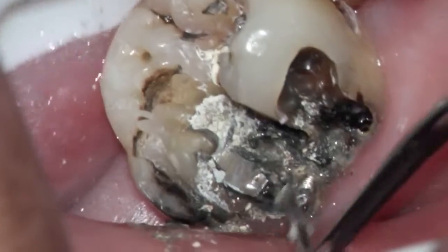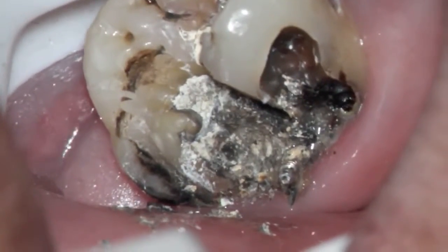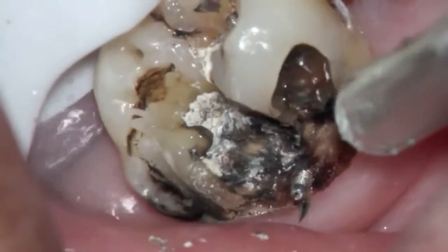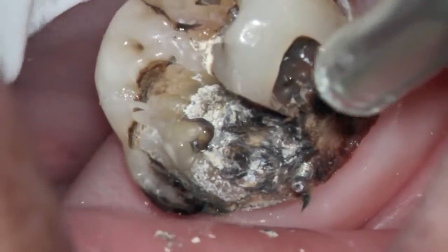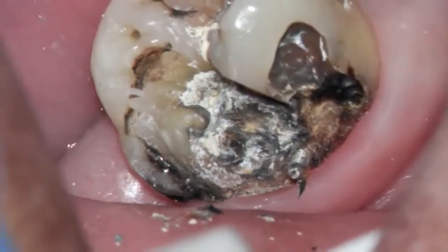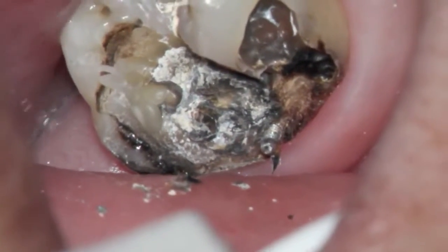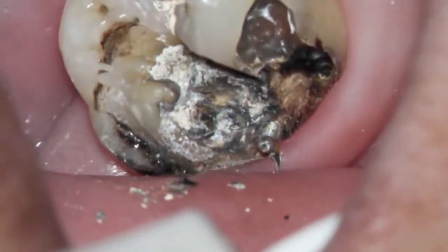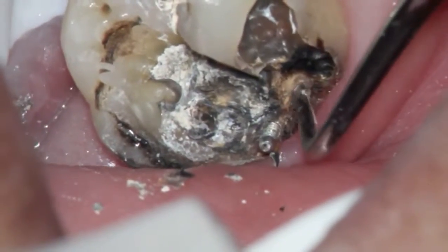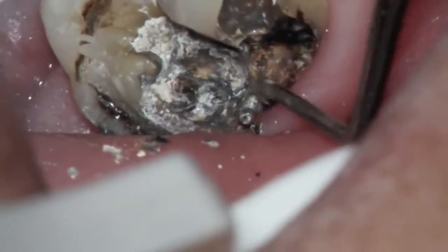The person, as you can see, there's the silver that came out, there's the pin that bent a little bit, all sorts of debris underneath that. As we clean it out, you'll see that that's full of soft tooth structure, and the material just peels out with a spoon. We'll go ahead and use a little spoon excavator just to get an idea as to how much actual decay is there in terms of depth. And teeth are supposed to be hard, not soft. As you can see, the brown material being peeled away is quite significant.